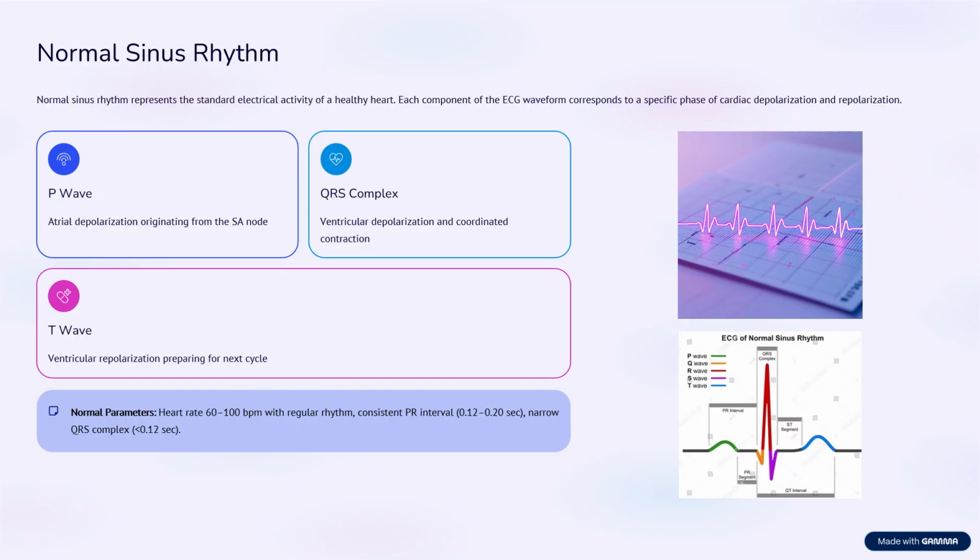Understanding normal sinus rhythm is essential. It forms the foundation for recognizing any abnormal rhythms. Students should take some time to memorize these normal parameters and practice reading ECG rhythm strips regularly. For additional practice, check the link on the last reference slide for an interactive ECG platform where you can test your skills and reinforce your learning in a hands-on way. Mastering normal sinus rhythm will make it much easier to identify subtle abnormalities when you encounter dysrhythmias in clinical practice.